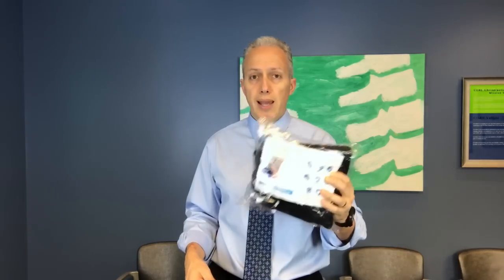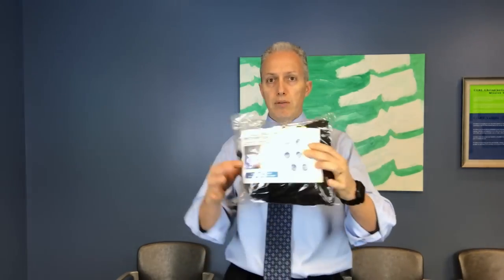This is called the neck hammock, it was about 20 bucks, and this is what you get — it's in a bag here.